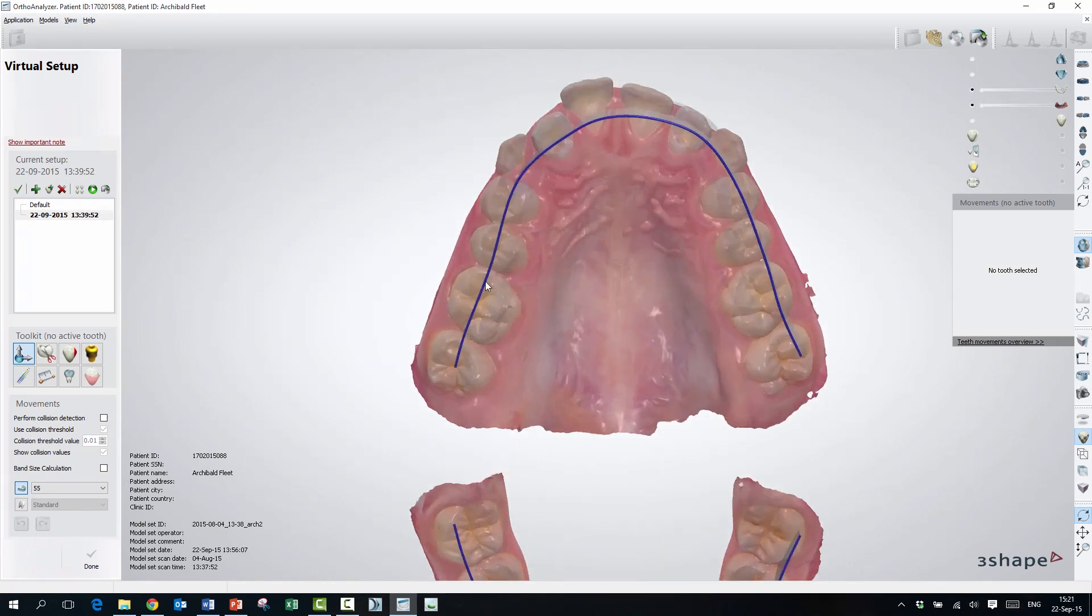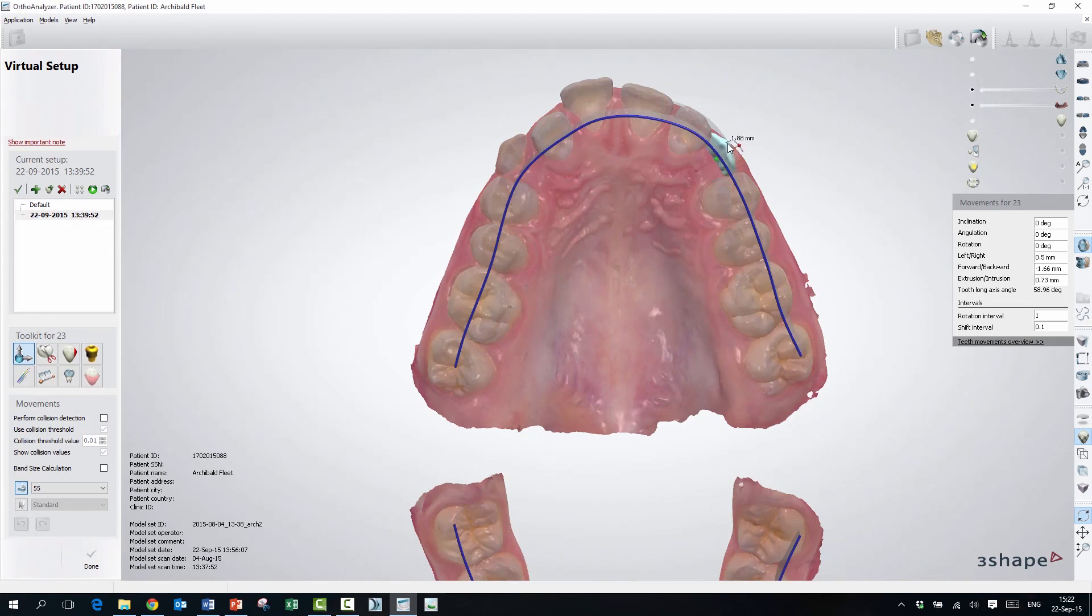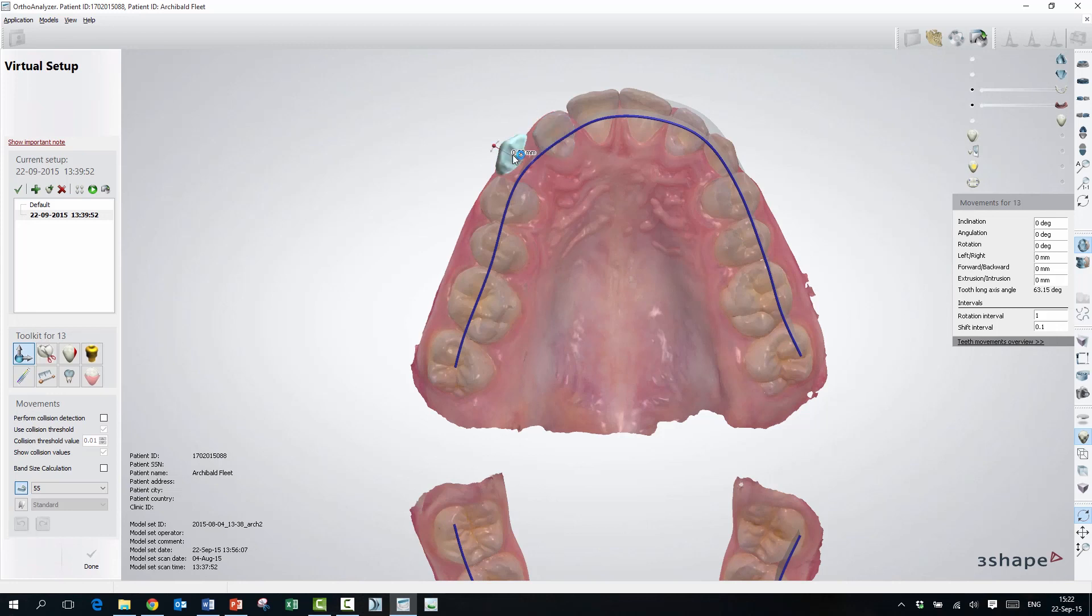I'll see it from this view. And now this is the arch that I've created beforehand, and now it's copied on the opposite side here. And if I now want to move the teeth to this created arch, I can have this as a guide to move my teeth into the arch as a speed guide.